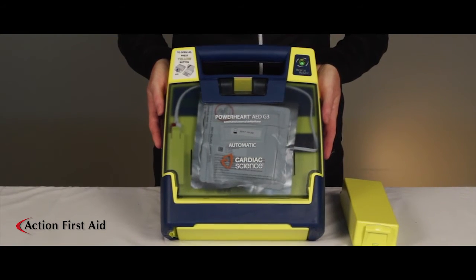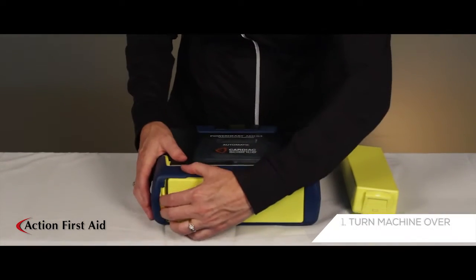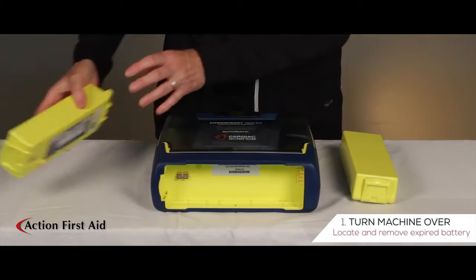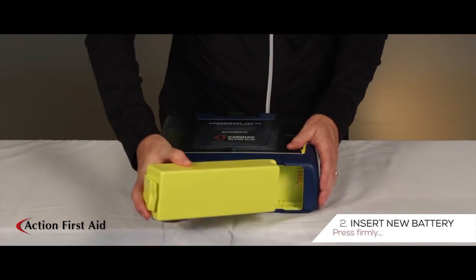Locate the battery on the bottom of the machine. Press down on the latch and remove the old battery. Insert new battery and press down firmly until it clicks.